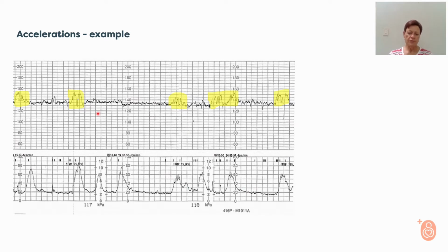Now, the other important thing that you see on this slide is this patient is in labor because there are contractions here. We have said that we always want to see accelerations during an antenatal CTG, because that tells us that the fetus is awake and his somatic nervous system is working because he moves, and when he moves we get accelerations.